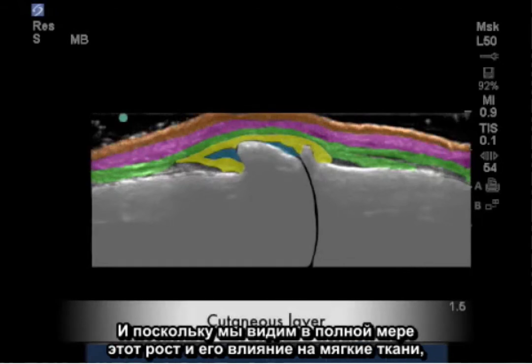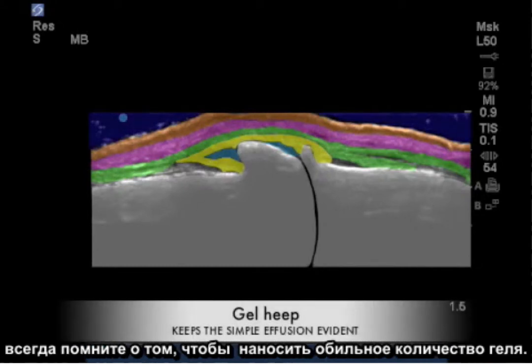So that we see the full extent of this growth and its effects on the soft tissue, always remember to use a gel heap.